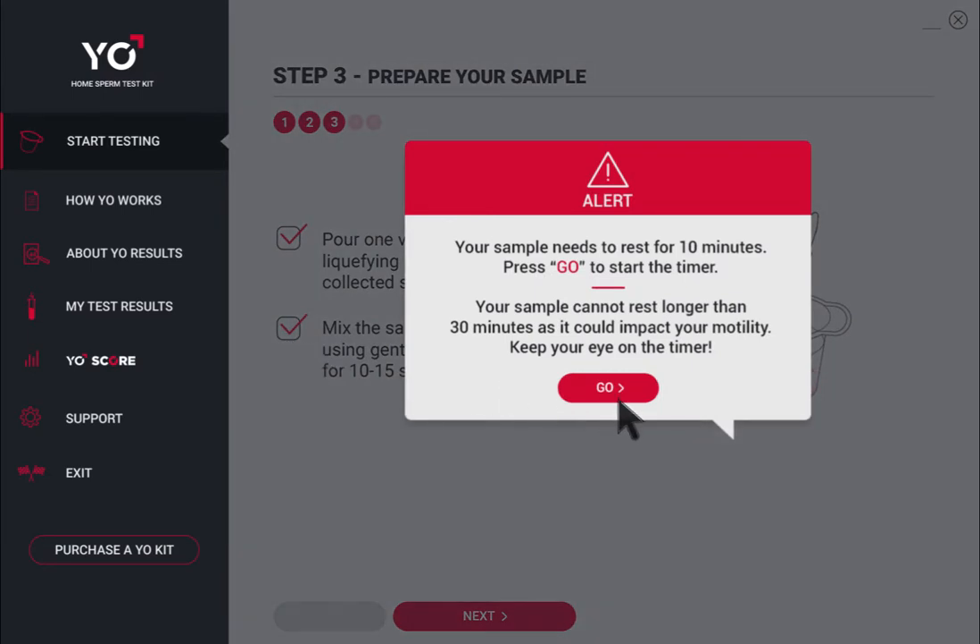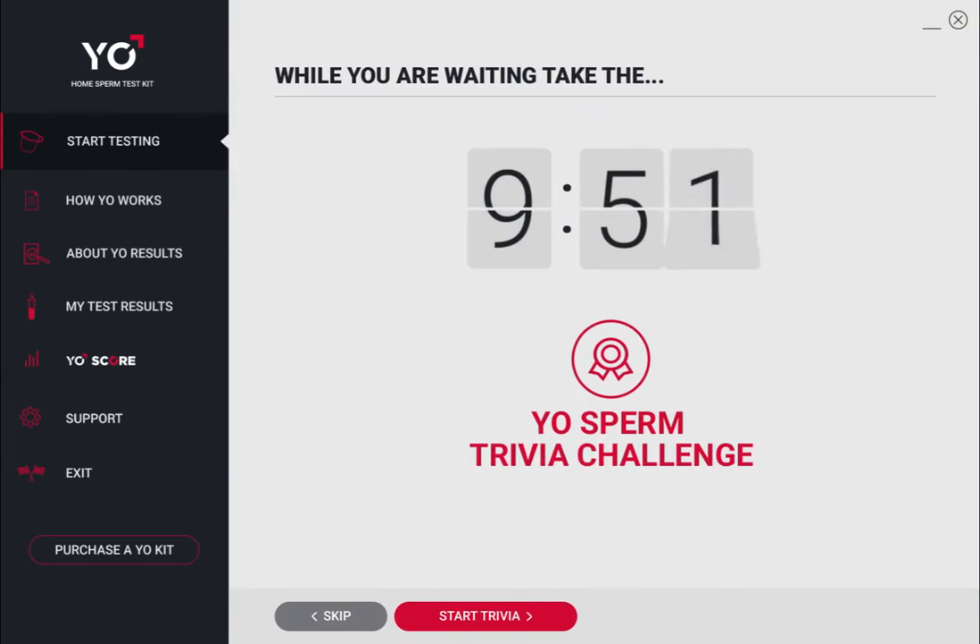Click Go to start the timer. While waiting, take the Yo Sperm Trivia Challenge to learn some fun and interesting sperm facts.